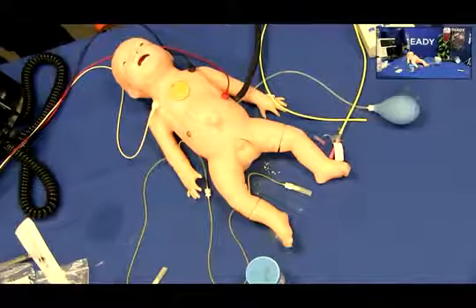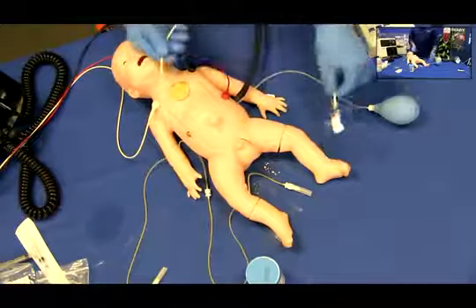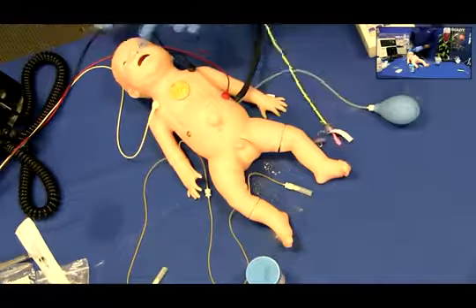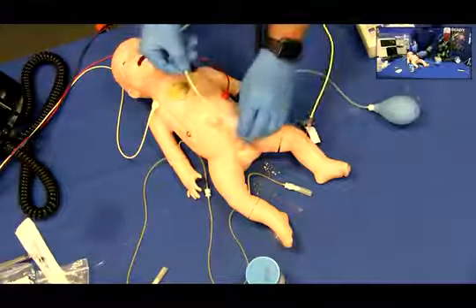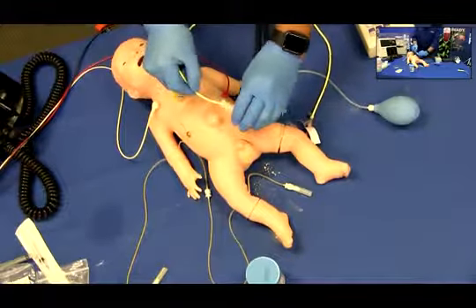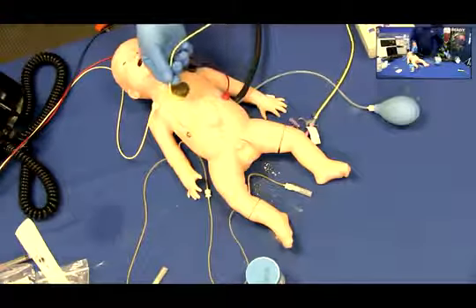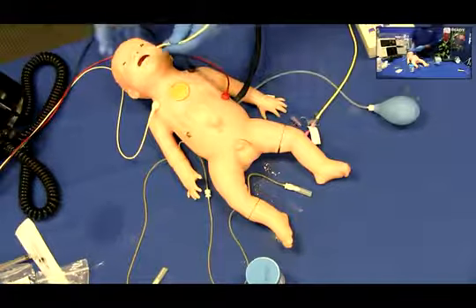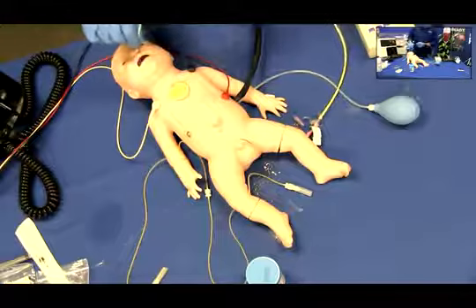Placing the NG tube. C.H.A.R.L.I.E.'s left nostril may be used to practice NG tube insertion and care, with tube placement only and no fluids recommended. Generously lubricate the recommended 8 French NG tube with the lubricant provided. Feed the NG tube through the left nostril and follow general practice guidelines to place the tube.